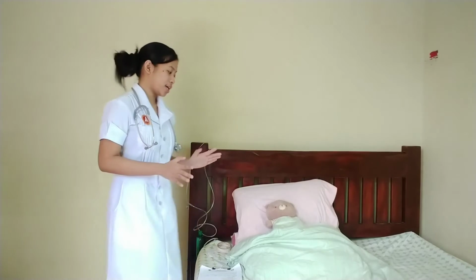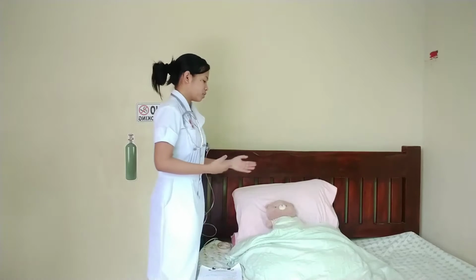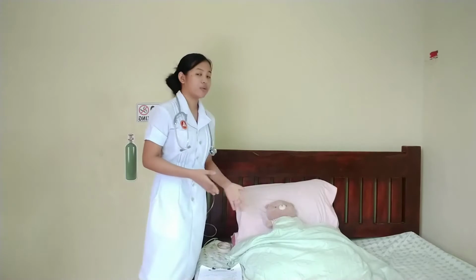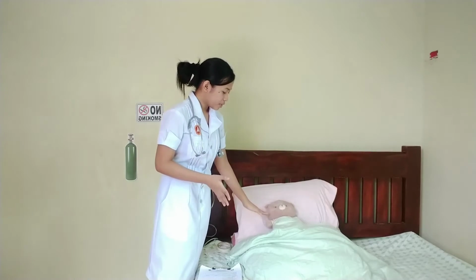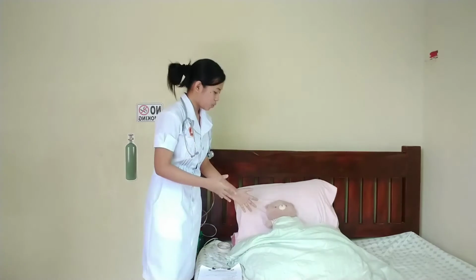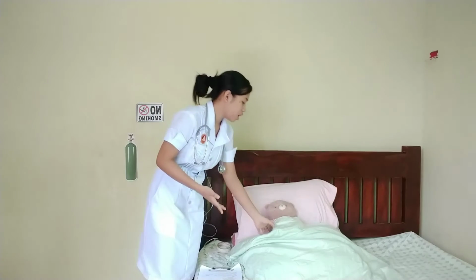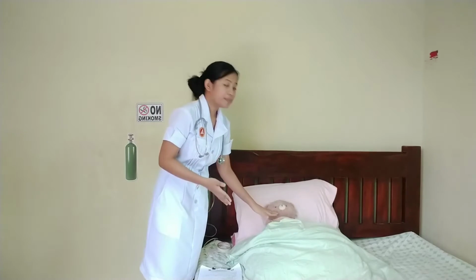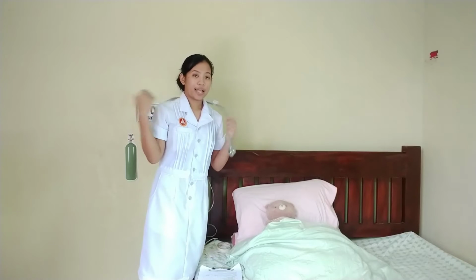I will be checking the skin and the mucous membrane color of my client. I will also be checking the breathing patterns and the chest movements. Also I will be checking the chest wall configuration, and then I will also listen to the lung sounds of my client.